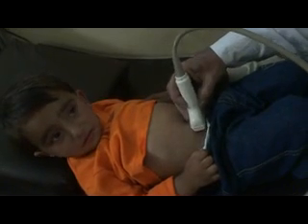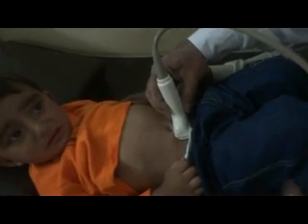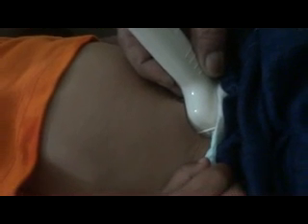This is the urinary bladder in transverse section, and here you are seeing a dense coarse echogenic area measuring approximately 8.2 millimeters, which is the calculus in the lumen of the urinary bladder. And that is the reason why this child is crying while he micturates.